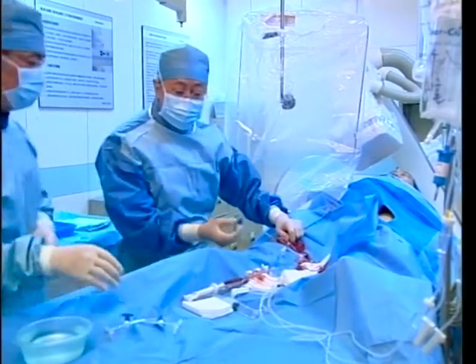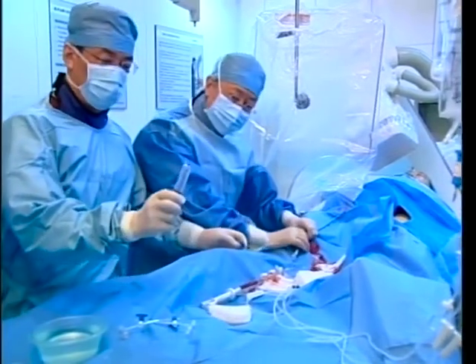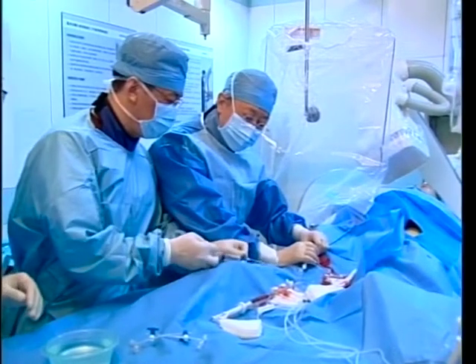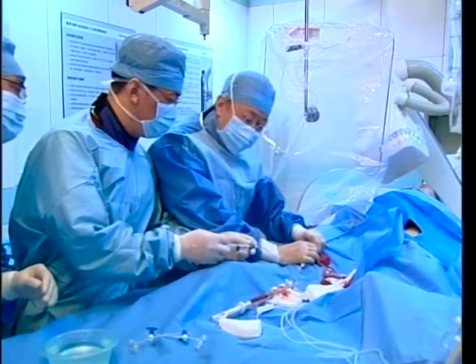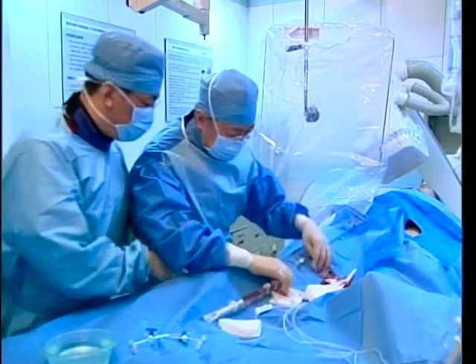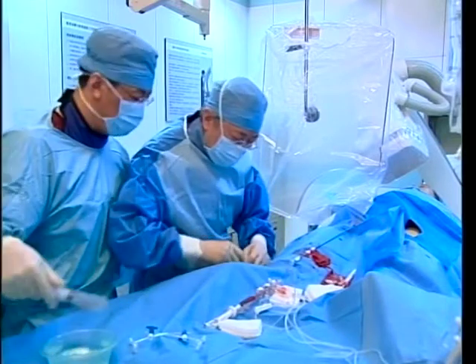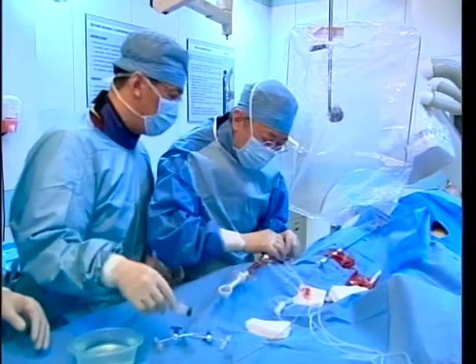So can you? Yeah, I think the beauty of the 10 French sheath is that the bigger concern I have is the caliber, you can use this sheath directly manipulating it in the appendage. Say again? Manipulating the larger sheaths in the appendage. The groin is not so important, but having a smaller profile. Yeah, that's absolutely true, but even to get them through the groin sometimes is, as you know, sometimes difficult, and sometimes the wire then bends and so on, in unexperienced hands at least, like myself.